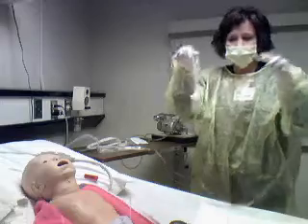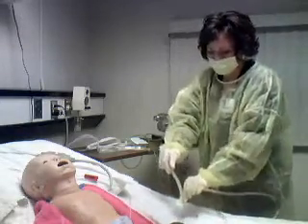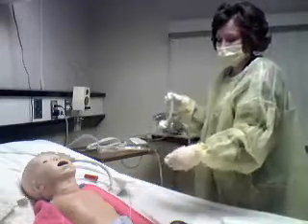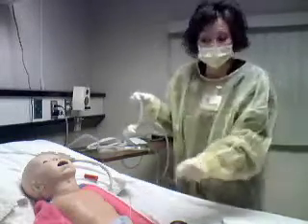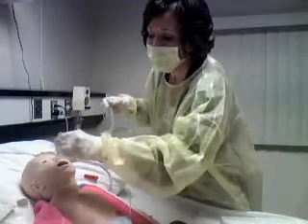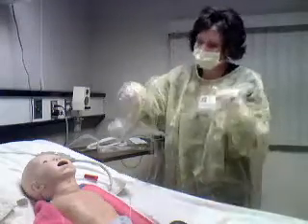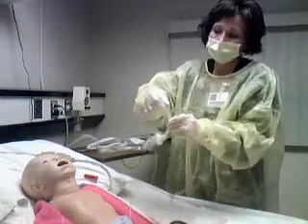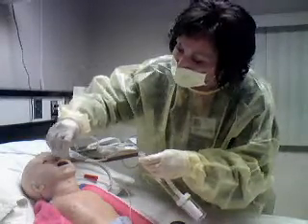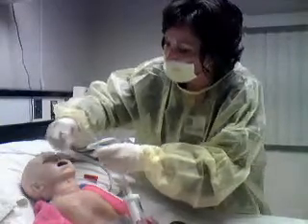This hand is now unsteriled. Somebody is holding the child, squirt some saline in, insert the catheter without suction — it needs to go back quite a ways. They will gag, they will fuss.